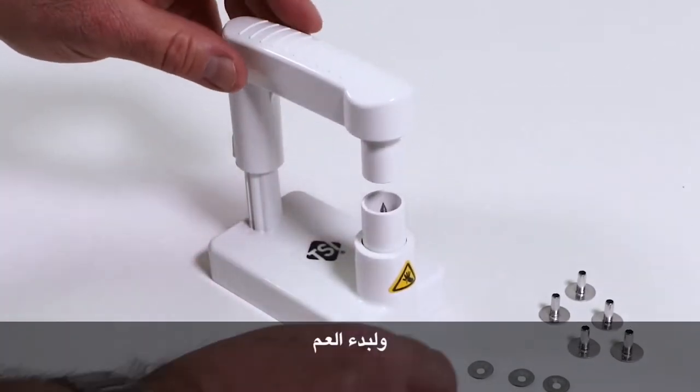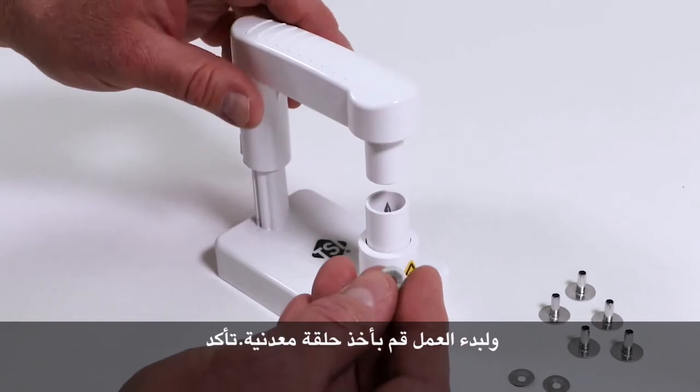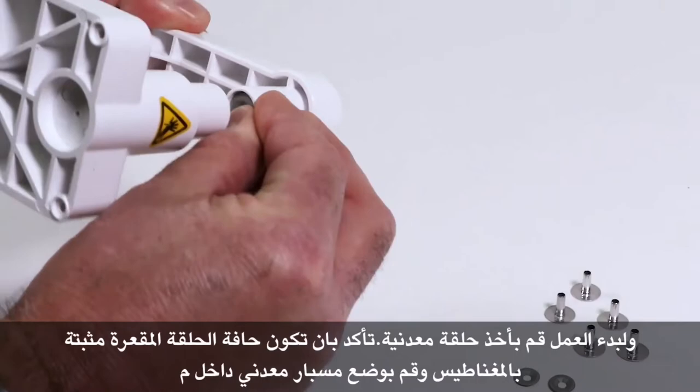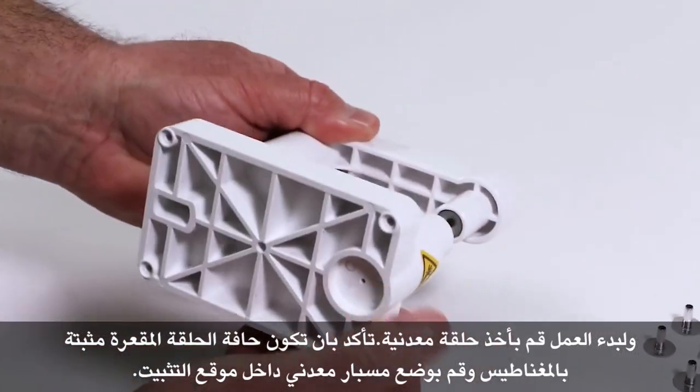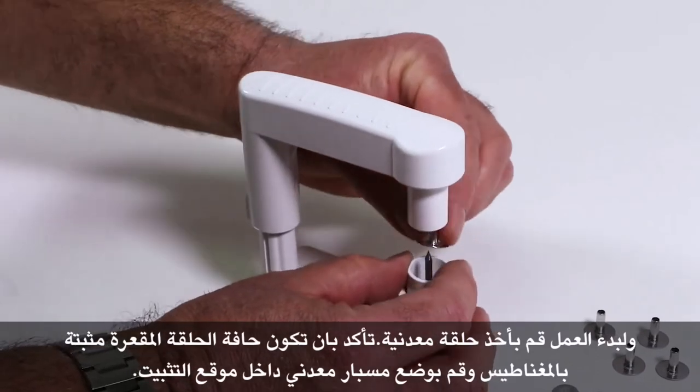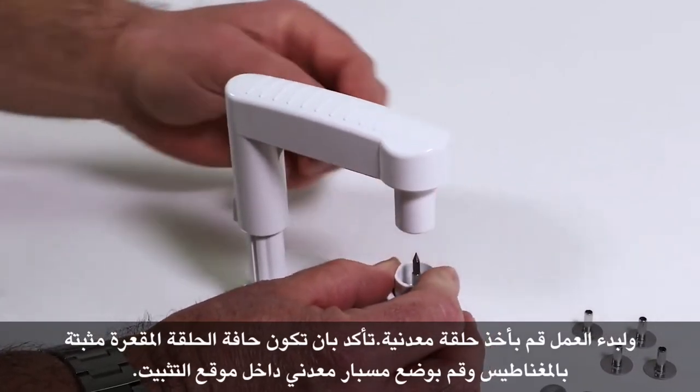To properly set up, we're going to take one of the push nuts and make sure that the concave edge of the push nut is facing toward the magnet. We're then going to put a probe onto the piercing tool.